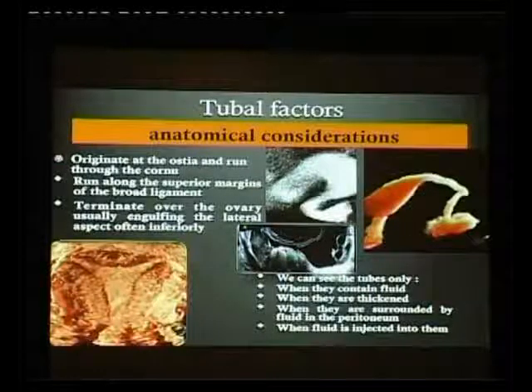We must remember to identify hydro, pyo, or hematosalpinx. The features of such a pathology would be that we would be able to see and localize tubular, sausage-shaped structures which are cystic. There could be the presence of incomplete septa. The mucosal folds will seem to protrude into the lumen but not reach the other end. So that is like a cogwheel and beads-on-string appearance.